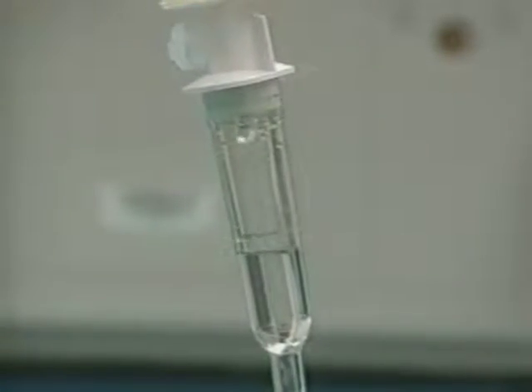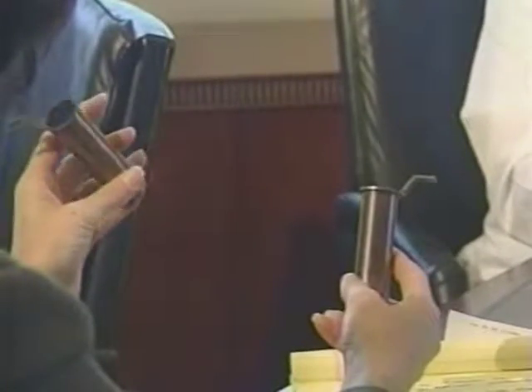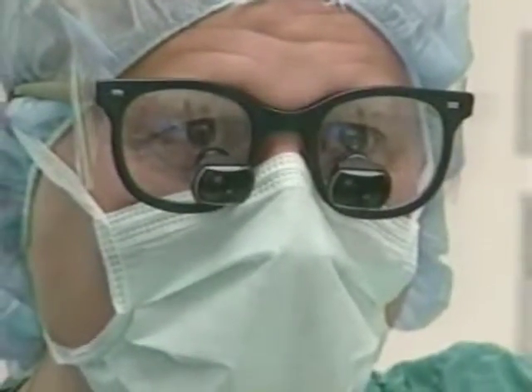The minimal access spinal technology, or MAST TLIF, lets surgeons perform the fusion through these inch-wide tubes. But the process begins with a knitting needle-sized tool that punctures through the muscle and gradually increases the opening. Then you sequentially place larger and thicker and wider hollow tubes over that needle, so it spreads the muscle fibers apart to the point where you have an inch-wide tube, and you can operate and do everything you want to do through that inch-wide tube.